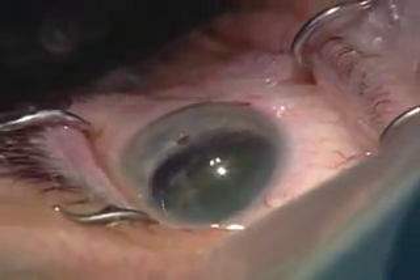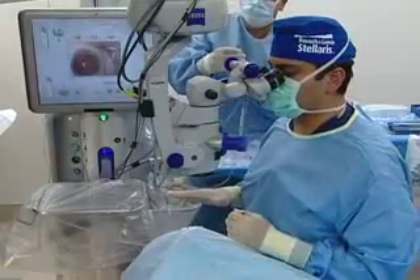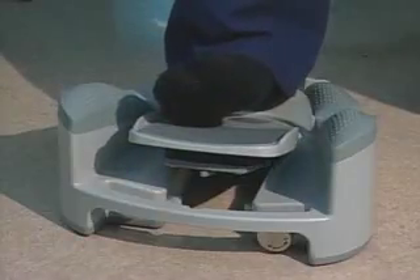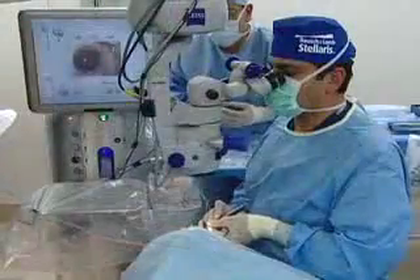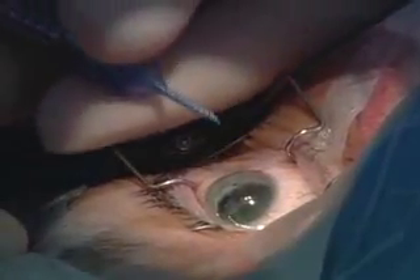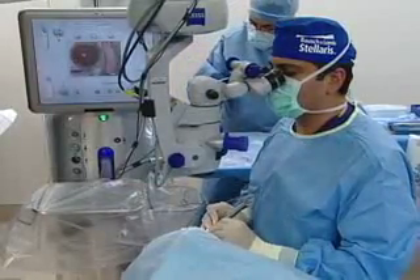Here's where I'll really make use of the dual linear. While Tony is preparing the FACO sleeve and foot pedal, I'll start by going down straight on the pedal, but when I want a good purchase on the nucleus for chopping, that's when I'll yaw my pedal to the right — on my settings that's like a turbo vacuum, even more vacuum. That looks like a good setup on our FACO needle. I also like to use the same chopper to lift the incision up.